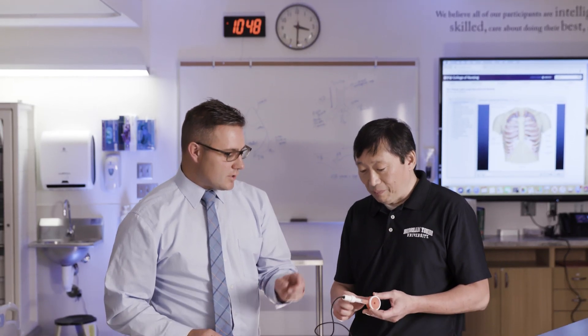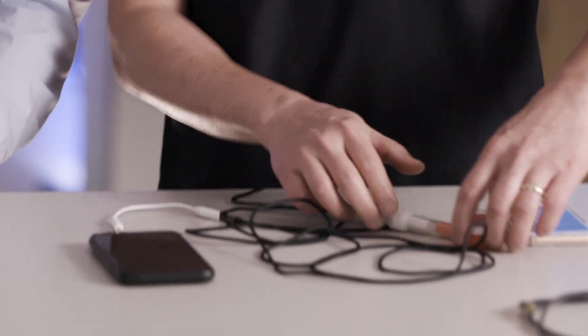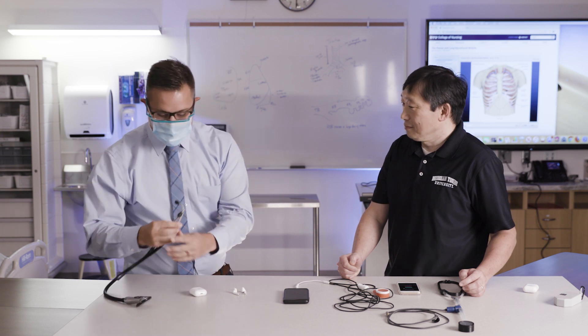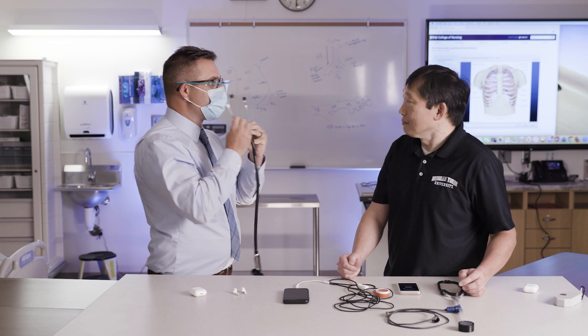I'd been working with Dr. Tang on this digital stethoscope for another project in India, and I thought this is the perfect application for this. I'm wearing a mask. This project set out to develop a really low-cost, easy-to-use digital stethoscope. We decided that to make a digital stethoscope accessible, the best way to do it just uses 3D printing.